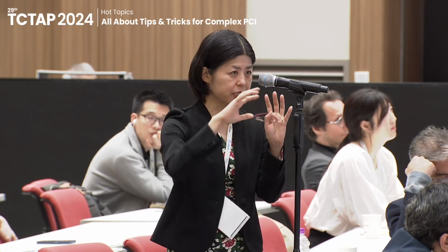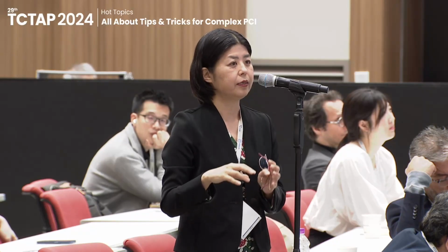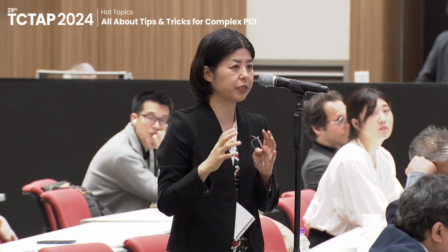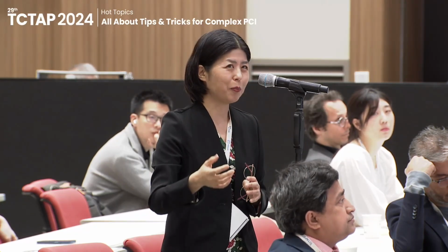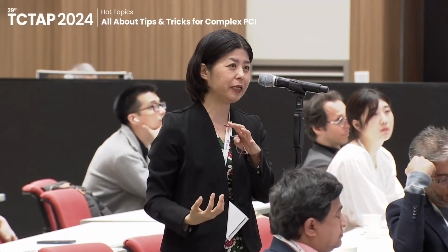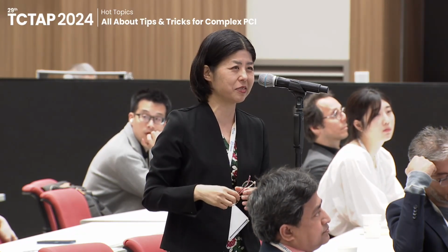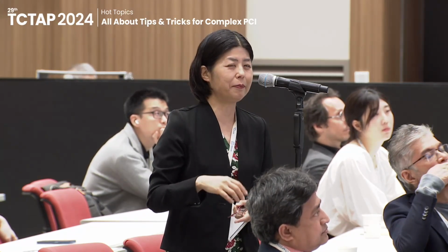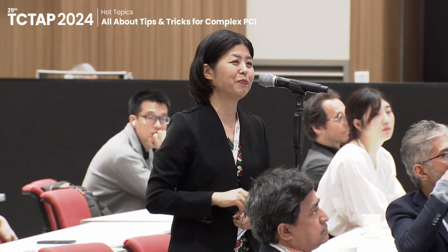So I think seeing the entire calcified plaque on top of the calcified nodule and making the best effort toward good expansion is the most important. That's number one. On top of that, because the eruptive one is going to reprotrude, it seems to be biologically more active based on the pathologist findings. And probably we need some medical therapy as well, but I cannot say too much about that.